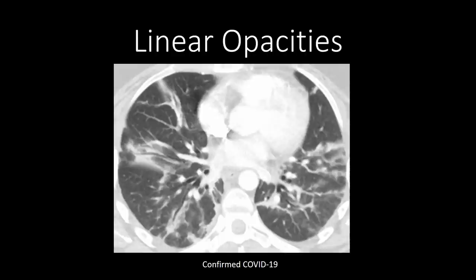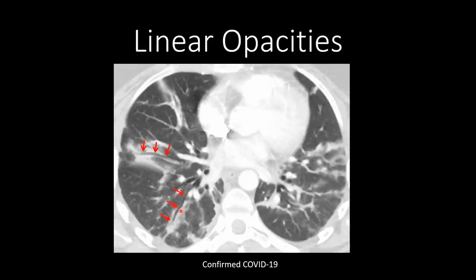This is a case of severe confirmed COVID-19 pneumonia showing a nice example of the linear opacities that are sometimes reported. This patient had ground glass predominant disease. In the right middle lobe you can start to see some linear opacities spread throughout the lung, associated with some ground glass opacity and some consolidation. We can also see bronchiolar dilation in the areas of abnormality.